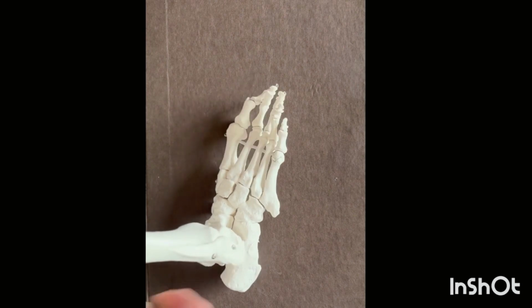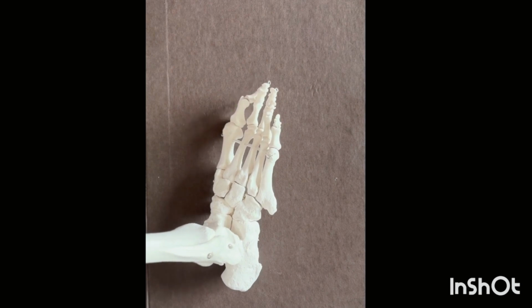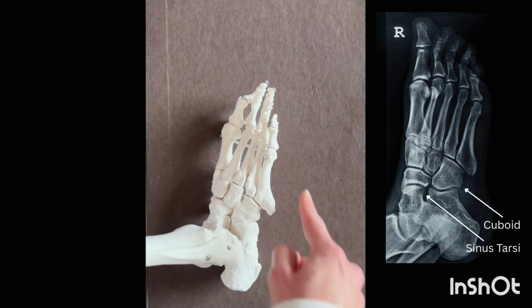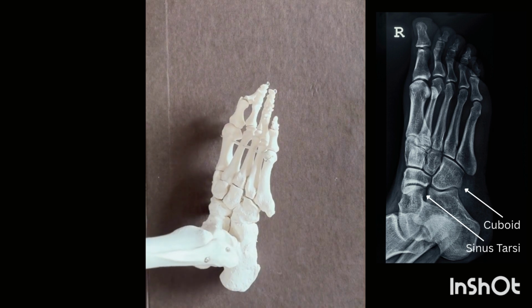That's going to allow that sinus tarsi, which is this area right here, to become more open. And then also you can see the cuboid laterally, you'll see that more in profile. And then also you'll see the base of the fifth metatarsal in profile as well.